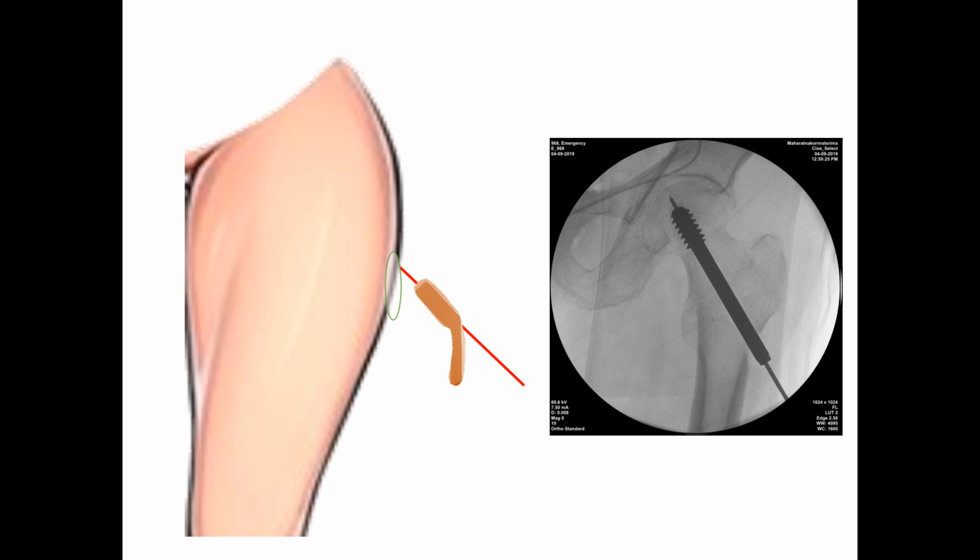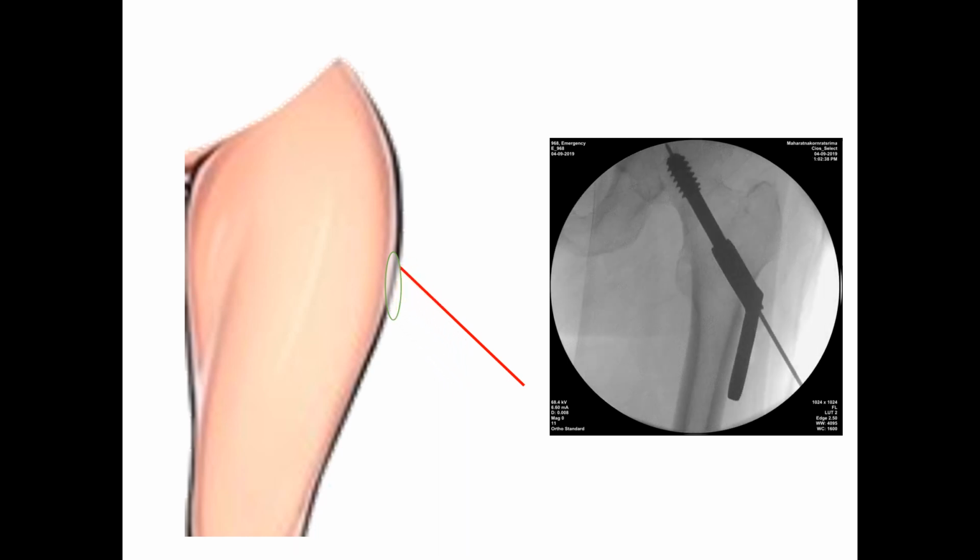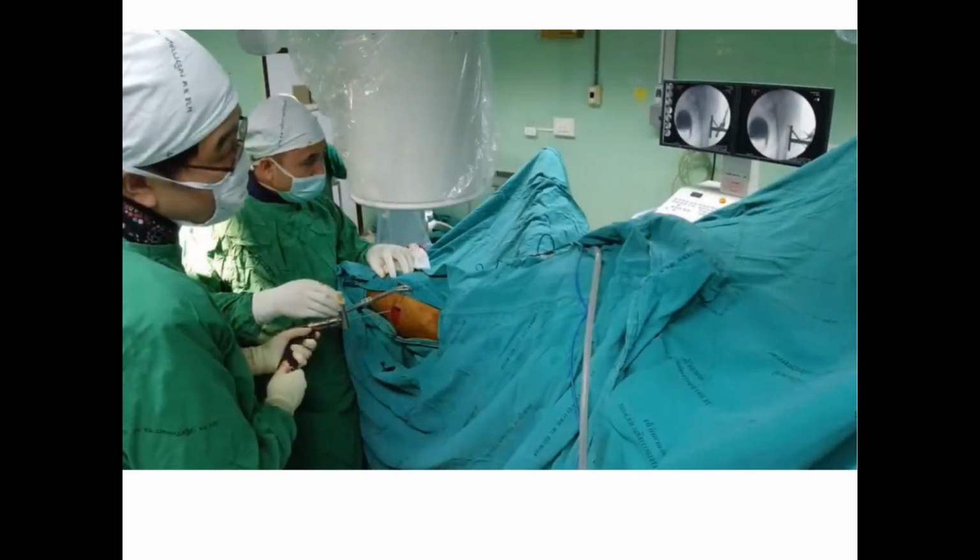Reaming was carried out through this incision. The standard hip screw and side plates are introduced through the small incision under fluoroscopic guidance. The guide wire can be removed and the plate slipped under the soft tissue until it is near the site of fixation. The side plate screws are placed in the usual manner by retracting the skin and soft tissue using a right-angle retractor. The side plate is fixed with 2 cortical screws. The skin is closed without drain application.